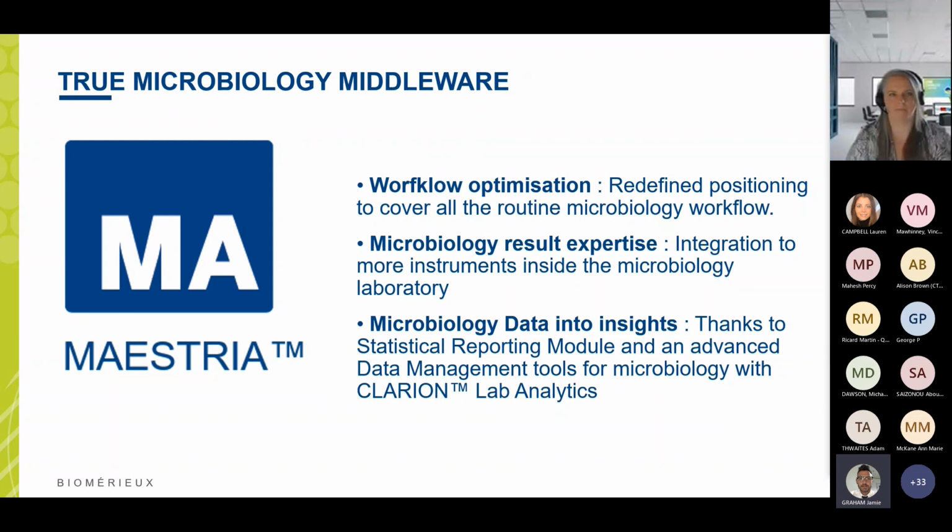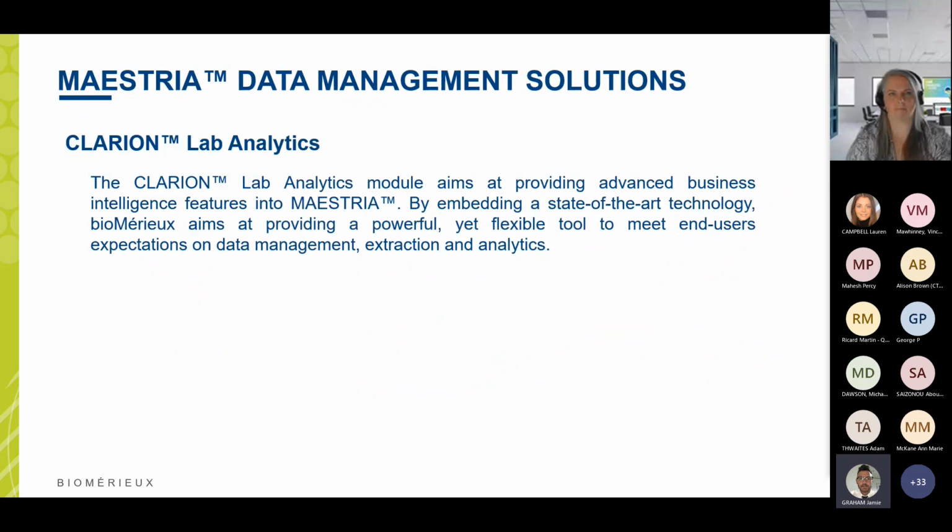And then finally, what we'll be concentrating on predominantly is the microbiology into data into insights. So this is possible because we've got a built-in statistical reporting module, but also the advanced data visualization tool, which is CLARION Lab Analytics. These are dedicated data management tools, which give laboratory workflow follow-up and surveillance activity. So the bottom line here is you don't need to be an IT expert to use data within your lab and bring actionable insights. If you could move on to the next slide, please.